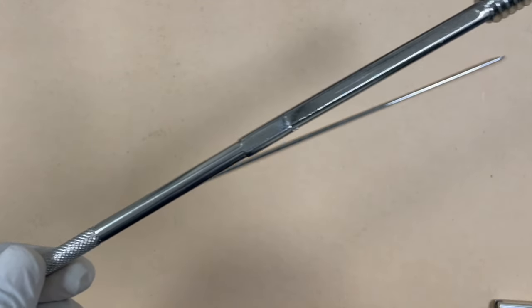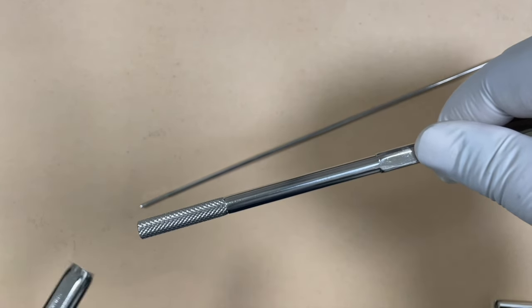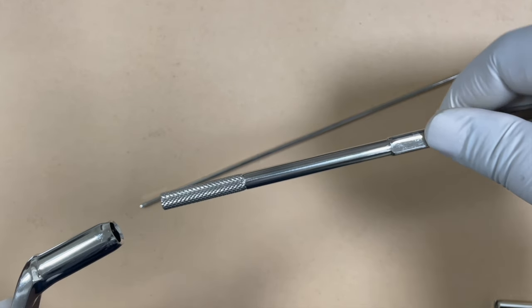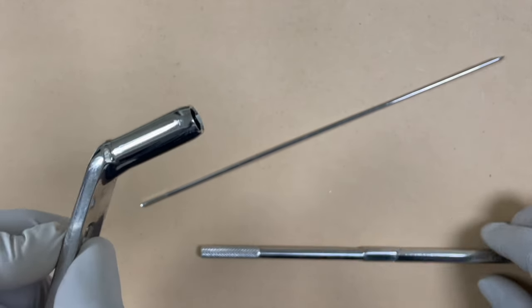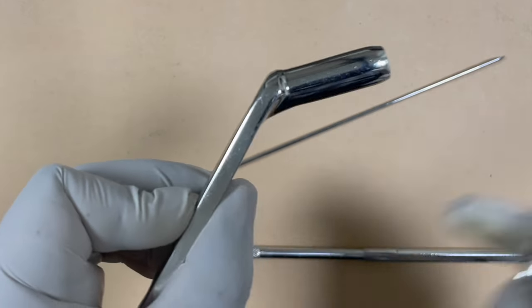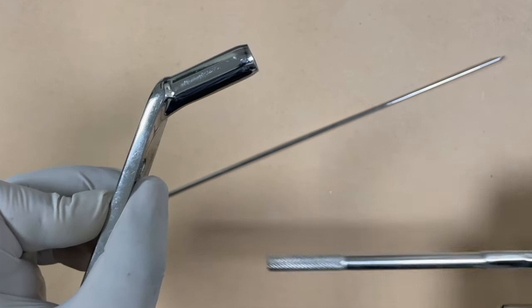Now for the barrel plate, you also need to select the correct size. If the lag screw is more than 80 to 85 millimeters, select the long barrel plate, which is around 38 millimeters in length. The short barrel plate has a length of around 25 millimeters. Check which one you are going to use, then slide the barrel plate over this area and slightly toggle it so it matches the surfaces.